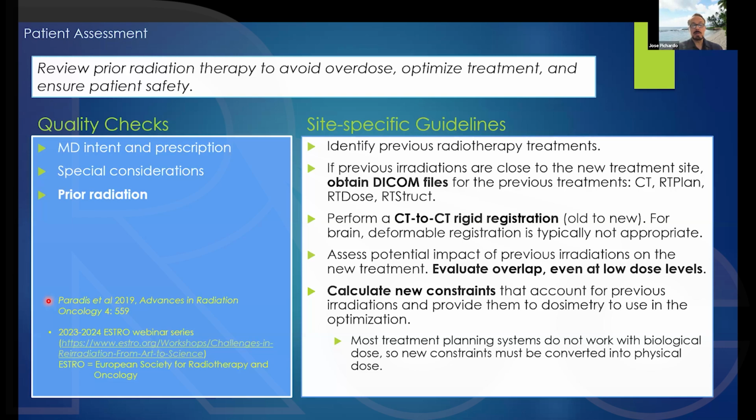The thing is, even in this paper, they mention to use it with caution, because these are numbers that they just came up with from their staff, from the radiation oncologists coming together and agreeing on something. There is some clinical basis for it, but it's basically subjective. There are no papers or studies that you can rely on to say, okay, it's okay to do this.